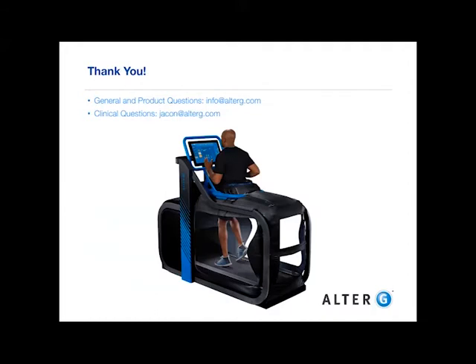So the studies that we have that have looked at EMG activity and gait mechanics, we've seen that the EMG activity peaks are less because with body weight support, there's less ground reaction. And because there's less ground reaction force, you don't really need to activate the muscles as much to affect impact on the joints. So the peak EMG activity is reduced, but the EMG firing patterns are preserved.